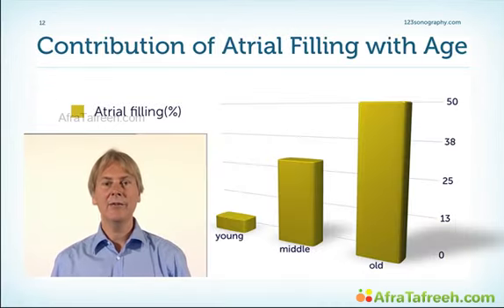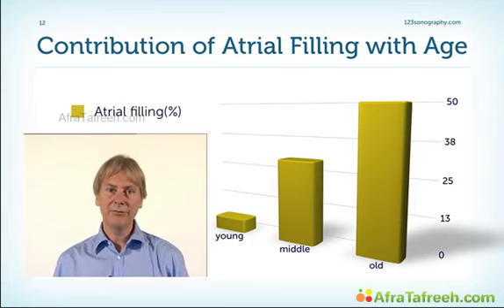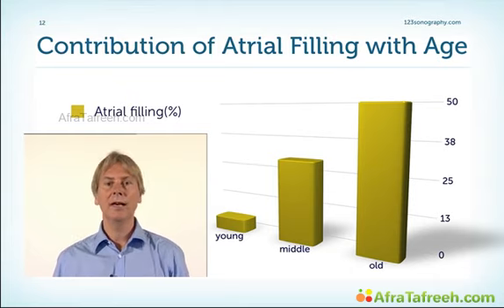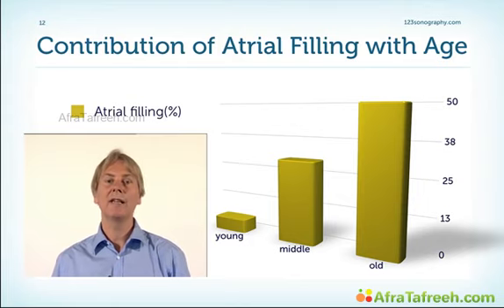So the size of the A wave, and in particular the area under the A wave, so nicely reflects the component of atrial contraction for left ventricular filling, especially if you relate it to the size of the E wave. And if we get older and the ventricles get stiffer, we have more component of atrial contraction, which is relevant for filling. This is also the reason why it's so important to maintain sinus rhythm in patients who get older and in patients who have stiff ventricles.